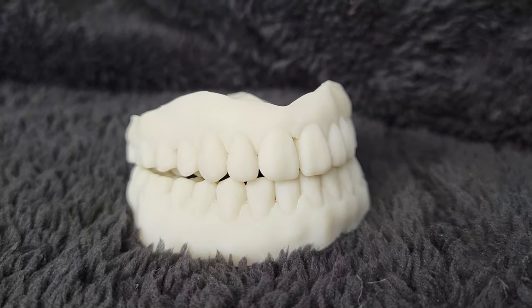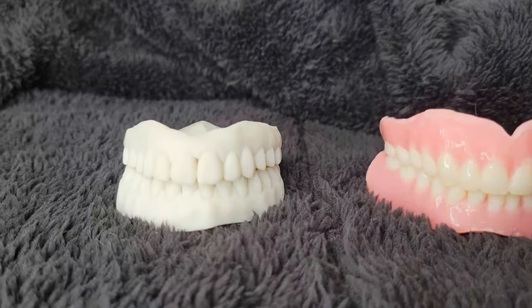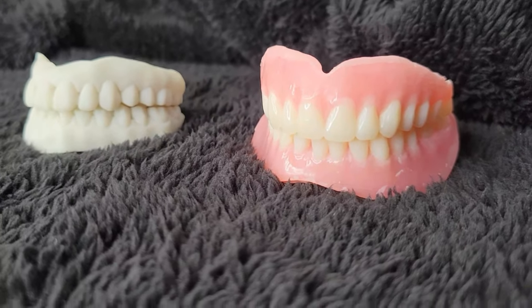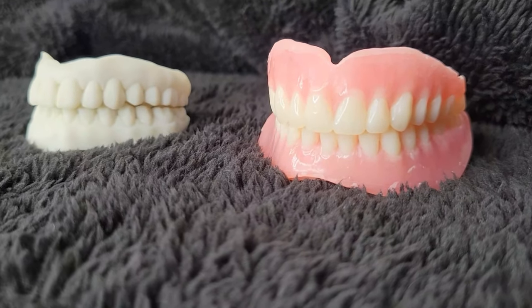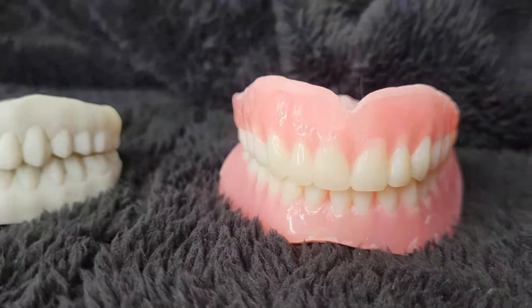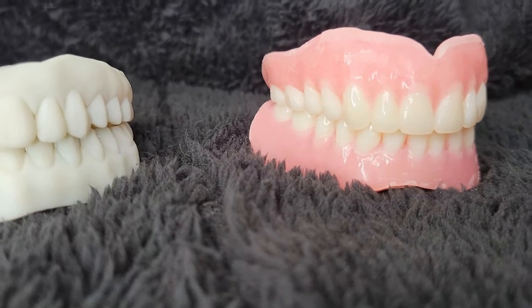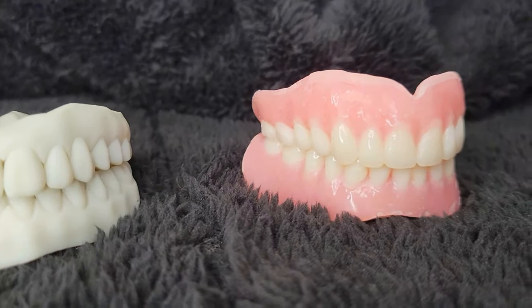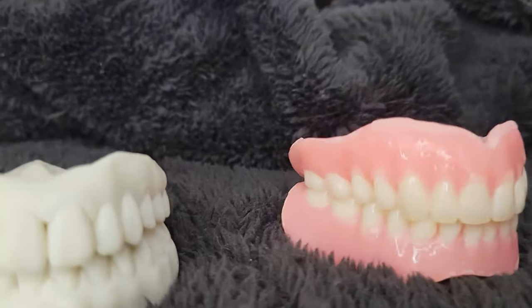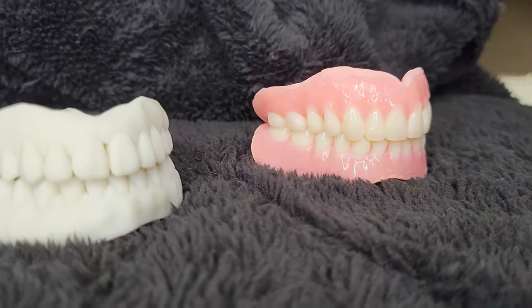Now I'm going to put my immediate dentures up here and show you the difference. I have them sitting on my black jacket just so you could see the difference. Do you see how big my immediate denture is? How high it comes up here? The gums on it are just huge. I had these impressions taken when I had my teeth, and then they took my teeth off the mold and made these dentures.